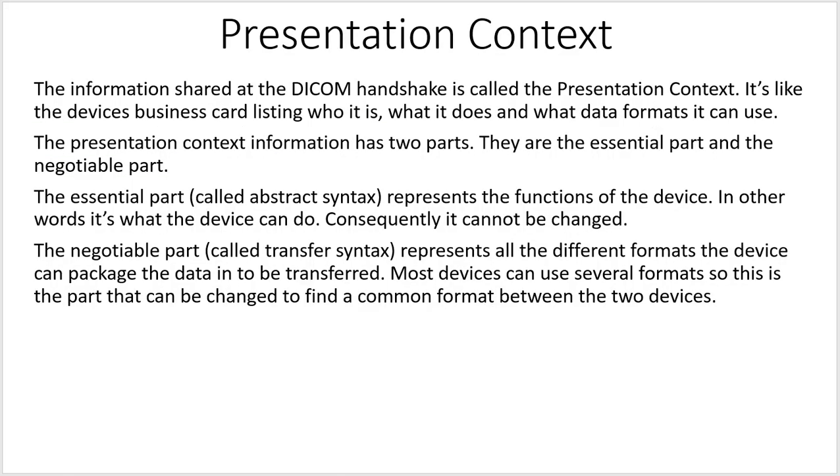Presentation context. The information shared at the DICOM handshake is called the presentation context. It's like the device's business card listing who it is, what it does, and what data formats it can use. The presentation context information has two parts: the essential part and the negotiable part. The essential part, called abstract syntax, represents the functions of the device. In other words, it's what the device can do.